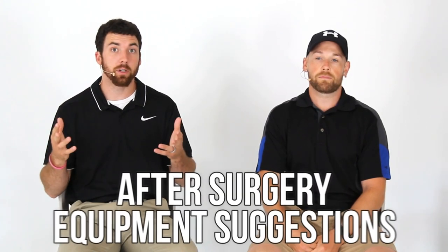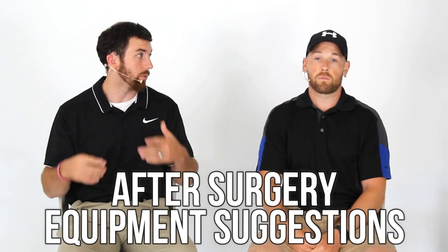This is the after-surgery equipment suggestions video. We're getting away from fitness for just this one video, but this is important. These are things that you will probably need and use — almost all of them — at one point during your recovery. Take note: every person has different needs. Some will require some of this equipment and others will not. We have 12 different products to talk about. Your hospital or doctor will probably give you a good chunk of these.